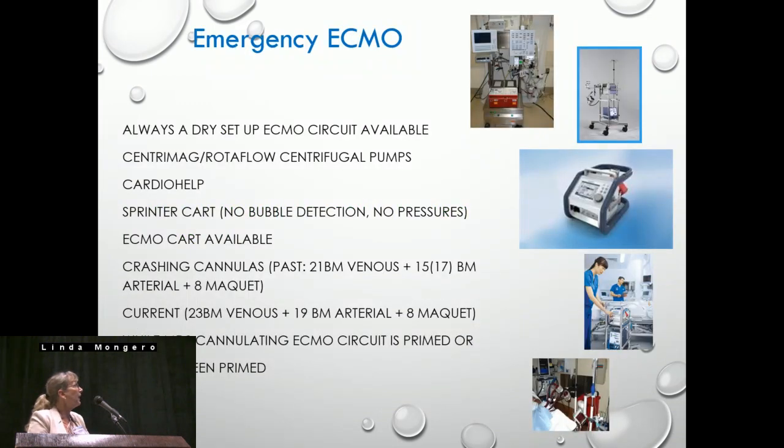Finally, emergency ECMO, it is here to stay. I totally believe it. I do believe that it will be in all of the ERs, and people will be trained, and they are quickly being trained. Most, I think, is due to the cardio help and the ability of its tiny use as a full heart-lung machine. Should always have a dry setup ECMO circuit available. We have papers now that show that at least goes out to 4 weeks and is still sterile. It probably goes beyond, and others will study that, but right now it's 4 weeks.